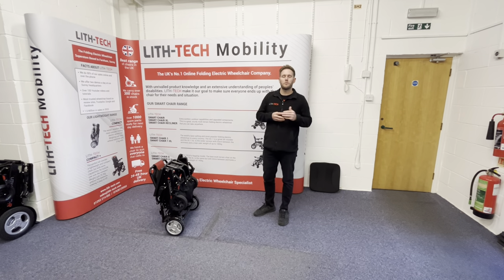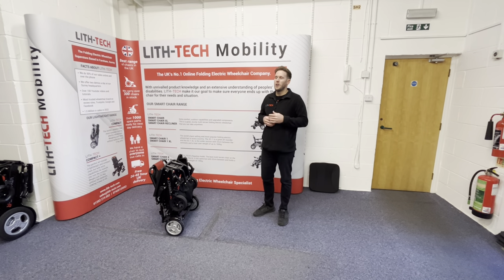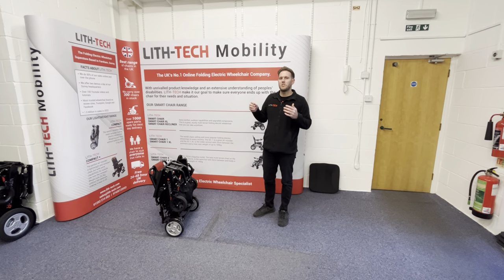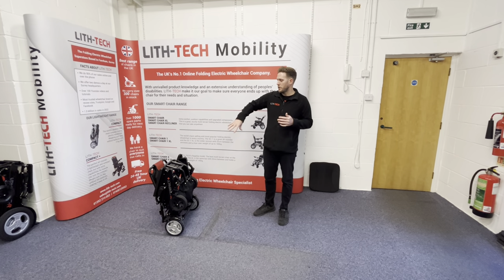We've got the Compact, which is fine — that's basically for around the home, like beach promenades and around Sainsbury's. It's very, very small and nimble, but it's never going to be as capable as either the smart chair range or something like this Compact Plus.